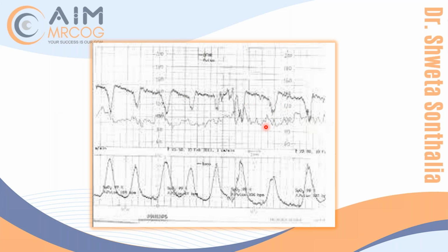Some of you said normal because you thought it is early deceleration, but early deceleration is only 5%. These are not similar looking: different size, shape, depth, acute drop. Unless we are seeing CTGs daily in our workplace, it's difficult for us. So please try to look for variable deceleration in every CTG, is my recommendation.